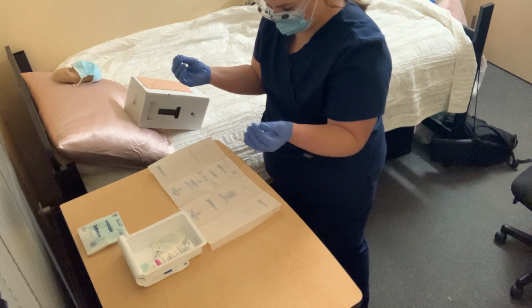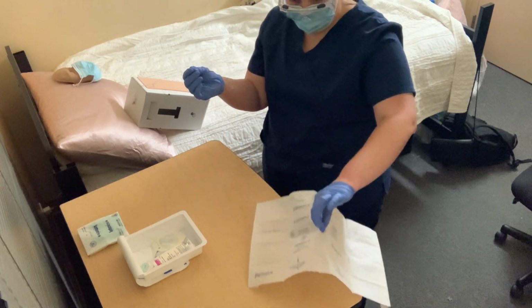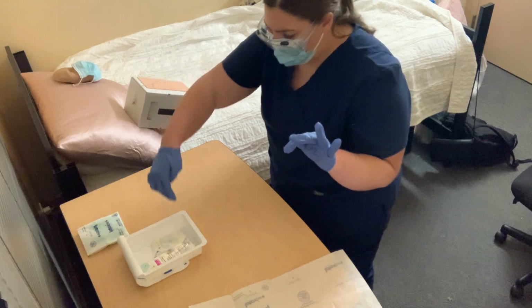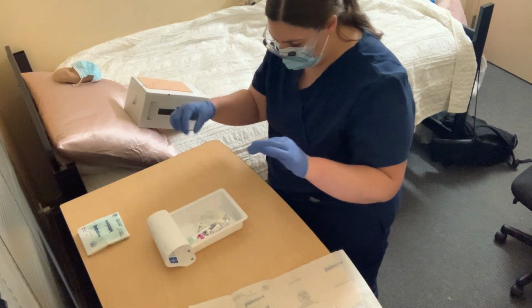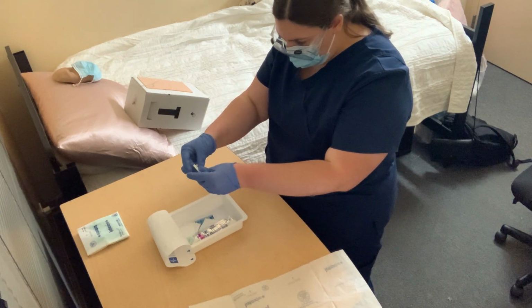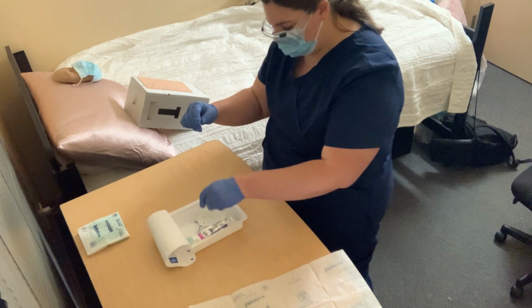I'm going to go ahead and grab the center of the paper that is sterile and just move it to the side while keeping my hands above my waist. I'm going to move the tray closer into my reach. And since both my hands are sterile, I can go ahead and put both in there to prep my tegaderm just by folding the back to make it easier when I need to open it up.